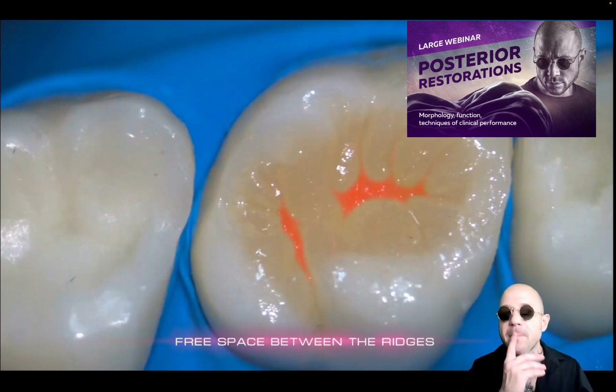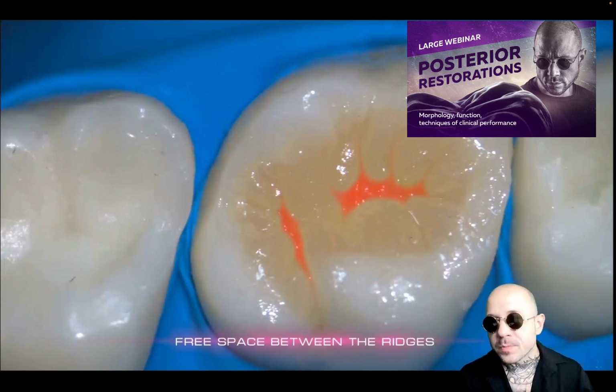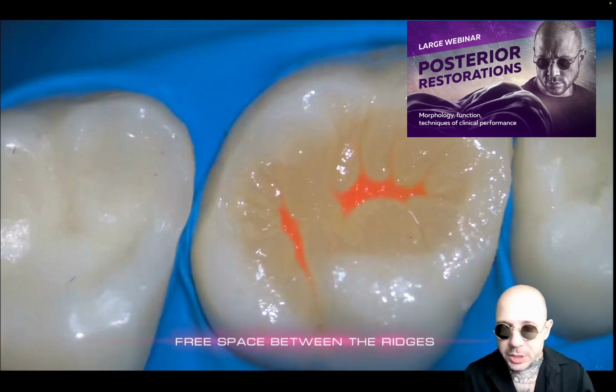I left some free space for the process of final modeling, which I frequently implement with a more bleached, whitish shade, imitating the hypermineralization of the ridges near the fissure.